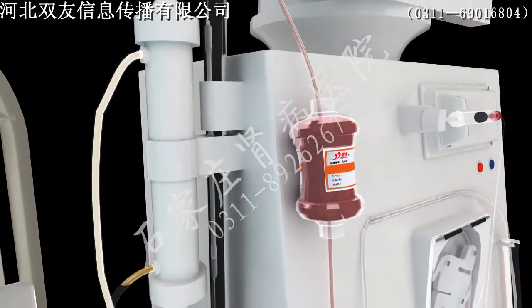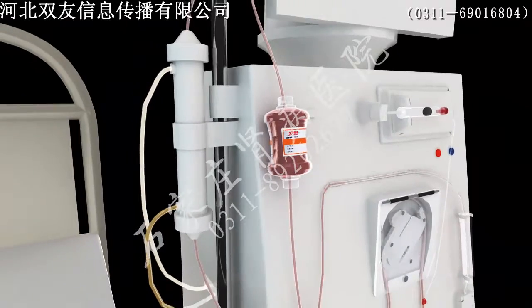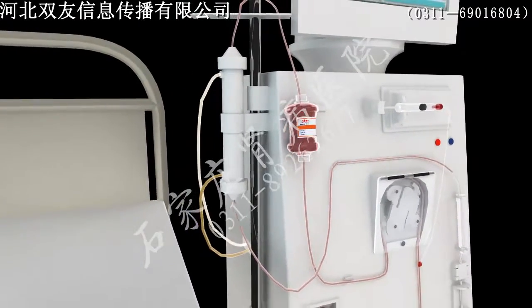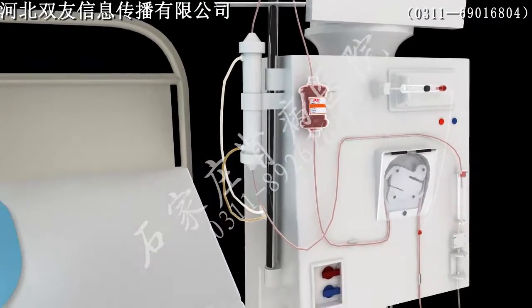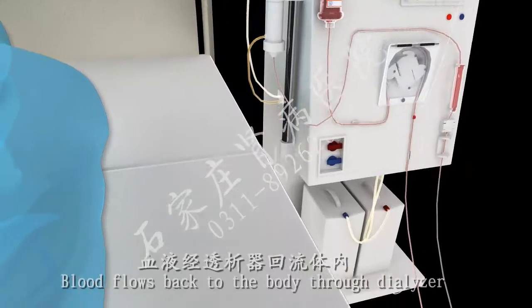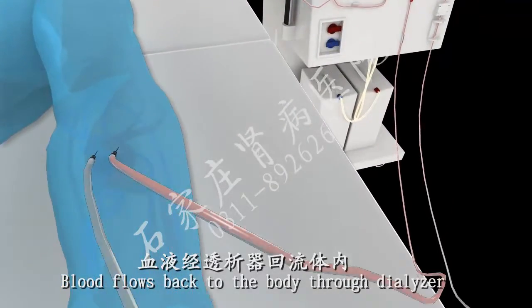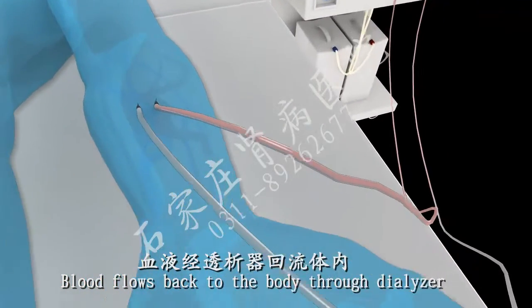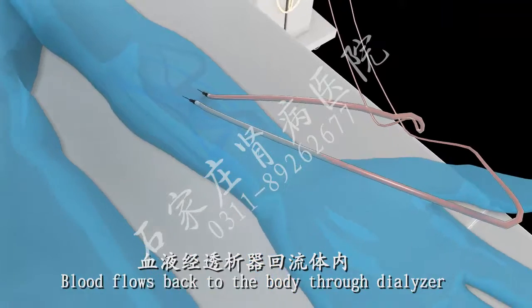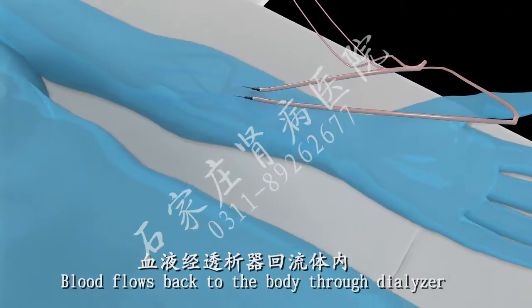Step 6. The purified blood returns to the patient's body through the vein. Blood purification, electrolyte and hormone supplementation can together eliminate the patient's metabolites, toxins, and uremic factors simultaneously.